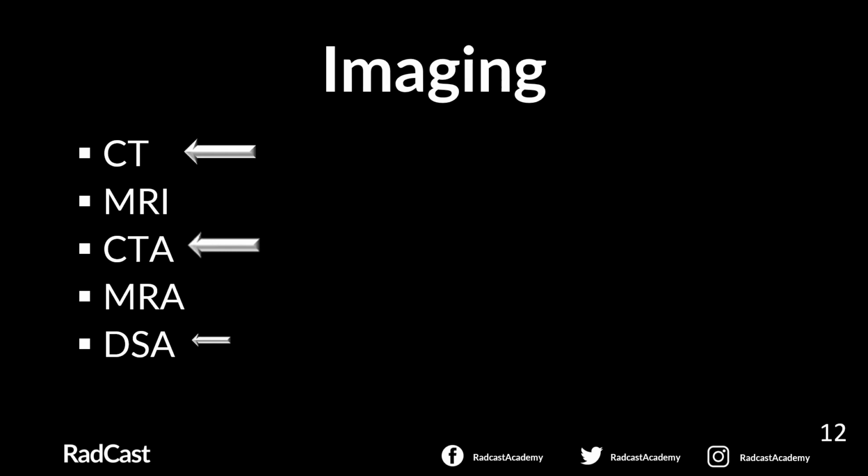So, what about imaging of subarachnoid hemorrhage? CT brain without contrast is the first imaging study we usually do when suspecting subarachnoid hemorrhage. It is widely available and highly sensitive to rule out subarachnoid hemorrhage, especially within the first 6 hours of headache onset.